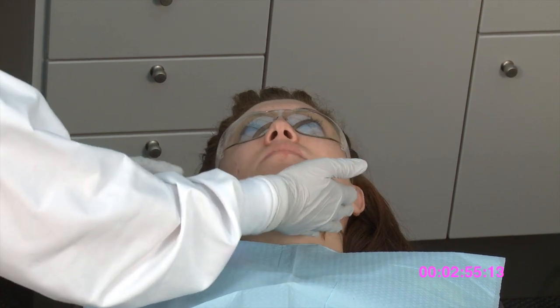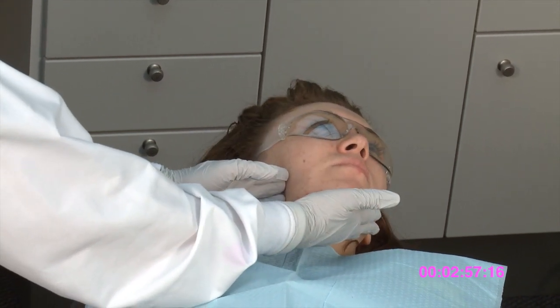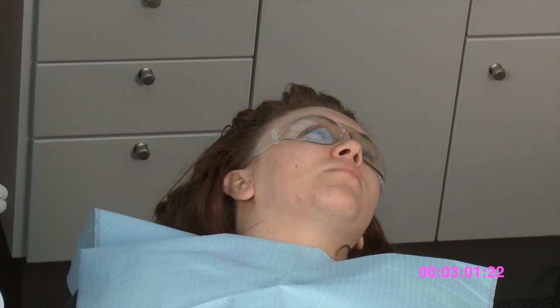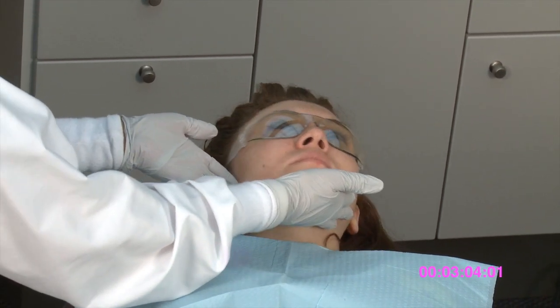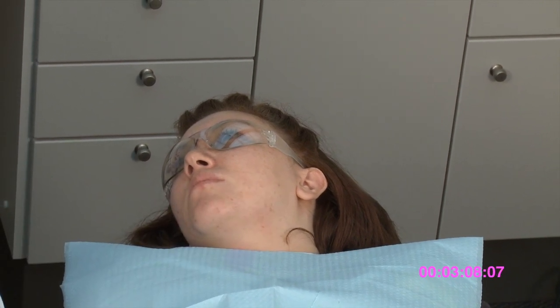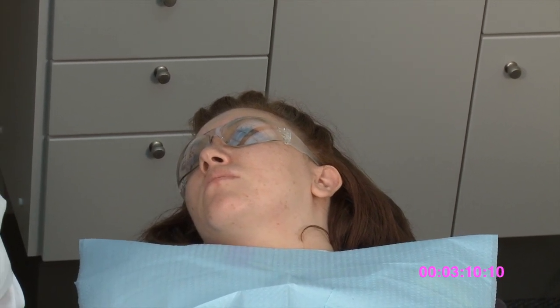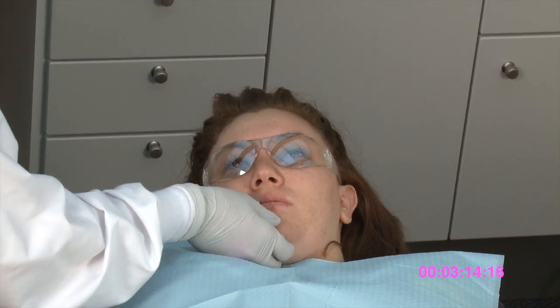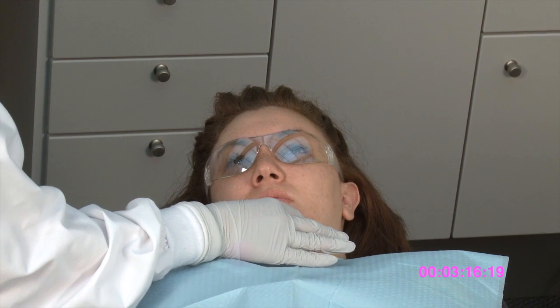Next, you will see the patient turn away. It is best to lightly guide the patient and ask them to turn away from you. Guiding the patient to turn towards you for surfaces that are further away from you will help with maintaining a neutral body position. Finally, sometimes it is necessary to have the patient turn neutral but drop the chin down to their chest. Often the clinician will need to guide the chin in the right direction.